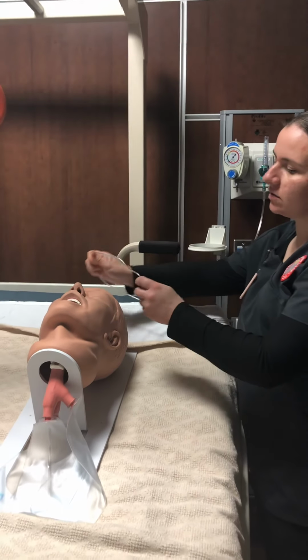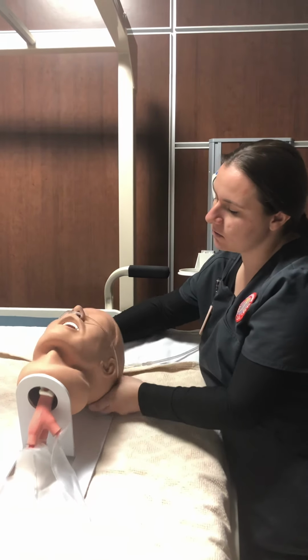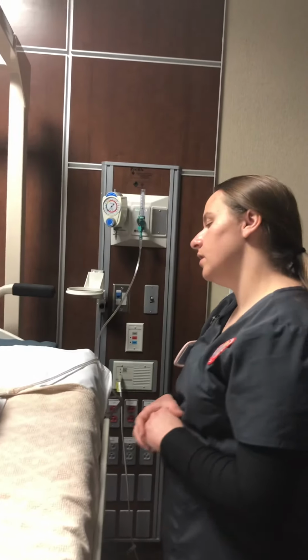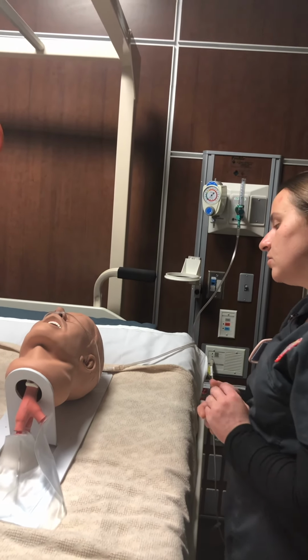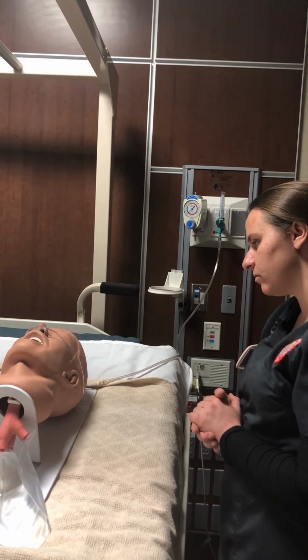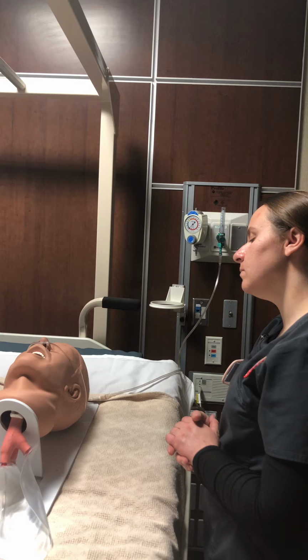With this, it needs to stay behind your ears. I'm going to place it in the nose and put it behind their head. Alright, so please don't remove this, as this can cause irritation to your nose, and it can also cause irritation to your ears. It can cause some sores, and then it's going to be very uncomfortable to wear it, okay? And I figured with this, you would be able to eat without having to remove it.